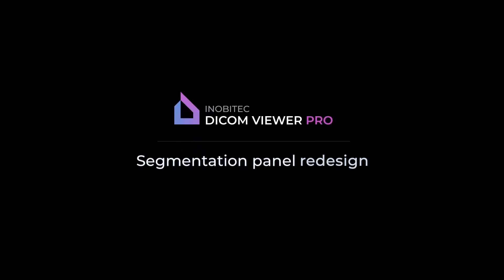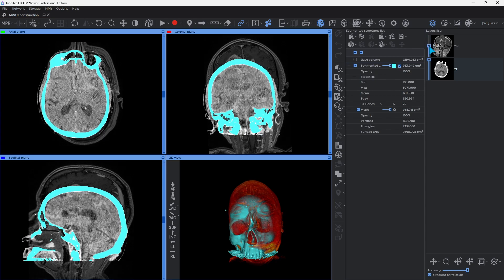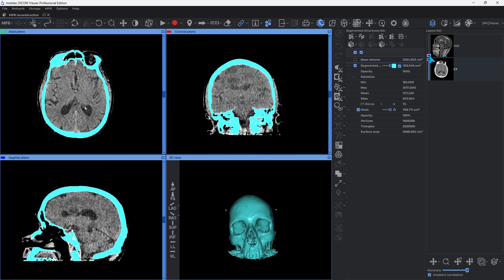Inobitech Dicom Viewer Segmentation Panel Redesign. Although the previous segmentation panel design provided efficient and fast work, we decided to enhance the interface with version 2.11, so you can feel more comfortable performing complex tasks.